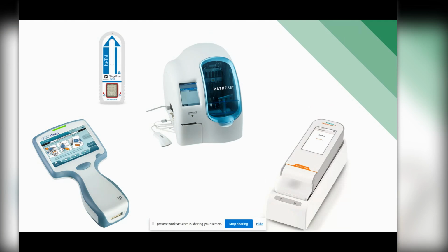And recently, as Fred has said, we've been looking more and more at point-of-care highly sensitive troponin assays. And the question then comes to us as clinicians about, can a point-of-care assay with a highly sensitive troponin result that provides us with information in less than 20 minutes, ideally less than 10 minutes, improve decision-making time and time for disposition? Because what I need to do is try and decongest my department.